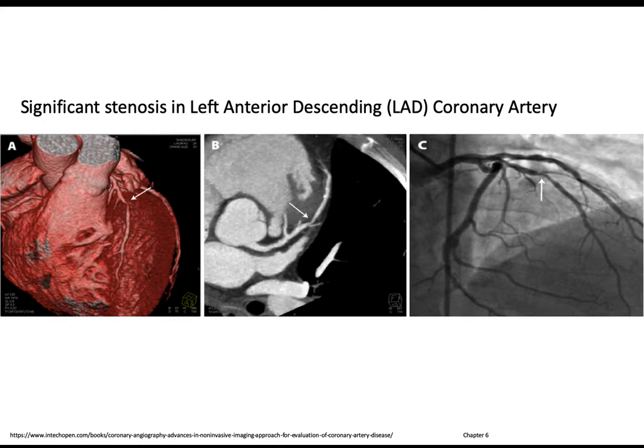Right? And so here I'm trying to show a couple different renderings. This is a volumetric rendering where you can actually rotate the heart and look. We've basically gotten rid of the myocardium through a visualization process and are only showing the blood pool. This vessel is supposed to taper off in a normal linear way as the vessel gets smaller and branches. So having anything where the vessel diameter decreases and then increases back up again is problematic.